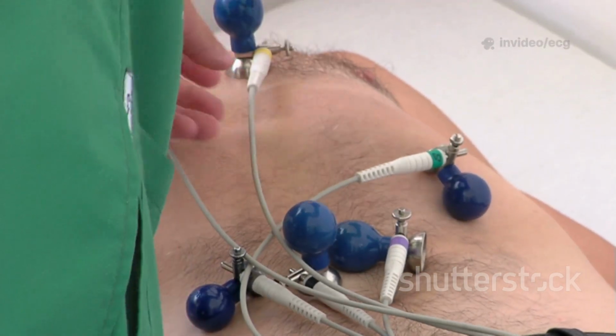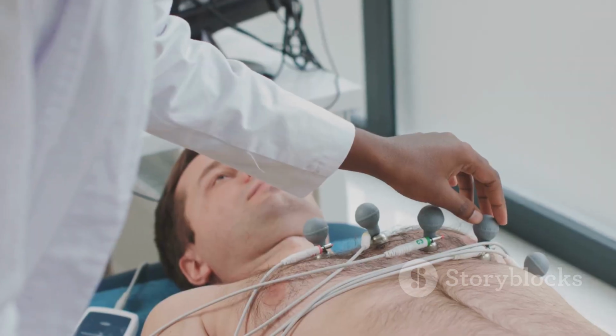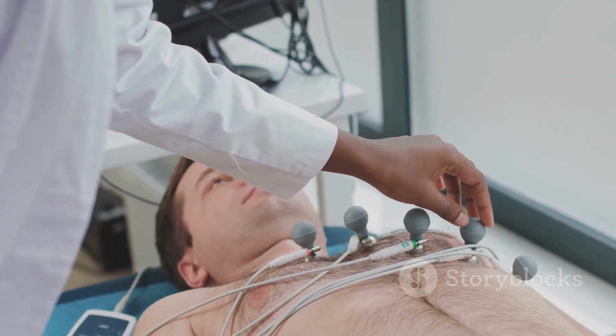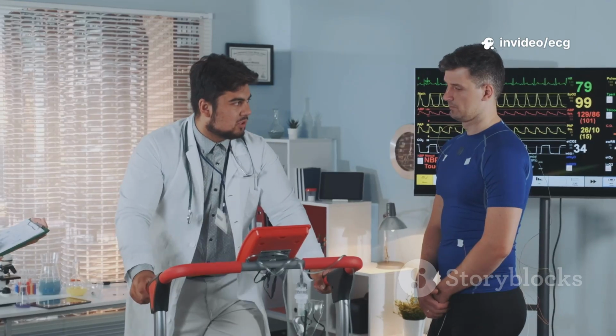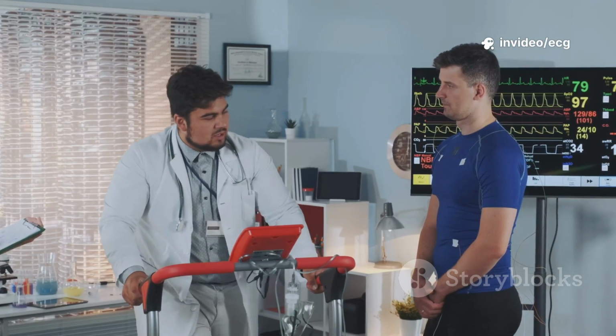Limb lead, right arm, RA. Limb lead, left arm, LA. Limb lead, left leg, LL. Limb lead, right leg, RL, ground.